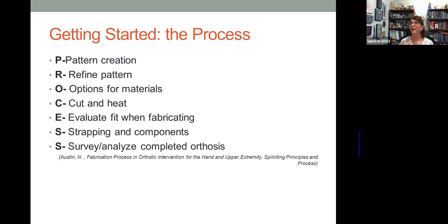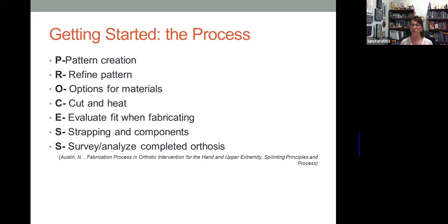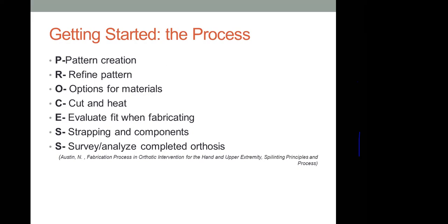And then the other one that I use for memory is called Orifit, O-R-I-F-I-T. That also comes in different thicknesses and different perforations, and they have one that has memory. Thank you very much. You're welcome.